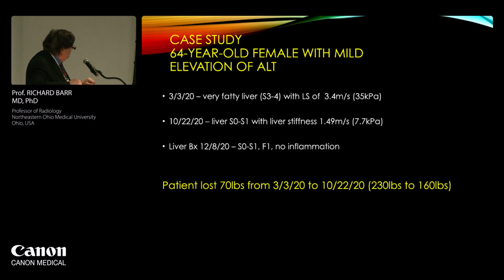So we do her in March of 2020. She's got an extremely fatty liver, and her liver stiffness is 35 kPa. Her doctor tells her, you've got cirrhosis, and she was really panicked. And he said, you've got a really fatty liver. She comes back 7 months later. Now she has only minimal fatty infiltration of the liver, and now it's down to 7.7 kPa.